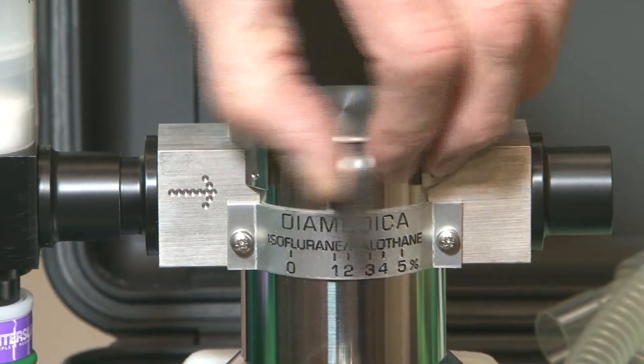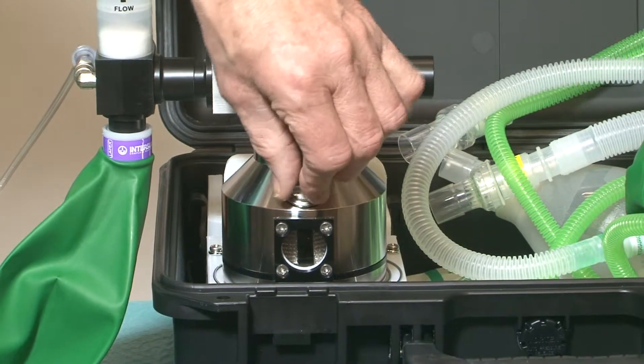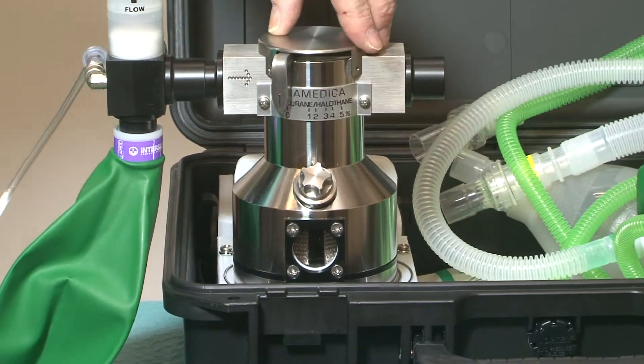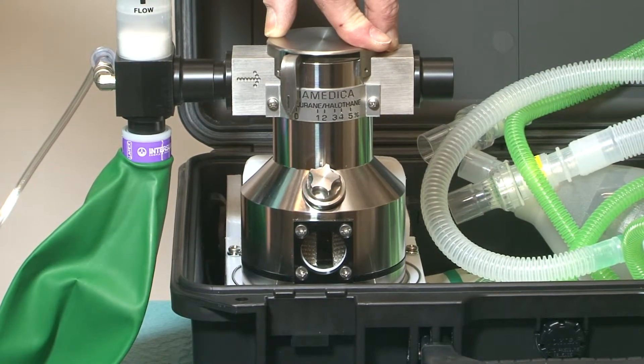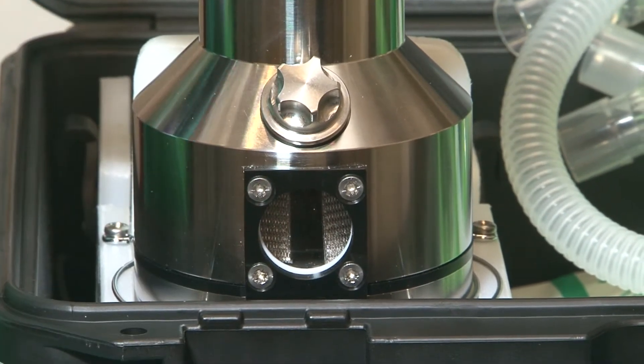The isoflurane/halothane vaporizer is calibrated for either agent. The vaporizer can hold up to 150 ml of anesthetic agent, and the level of agent should always be visible in the sight glass.